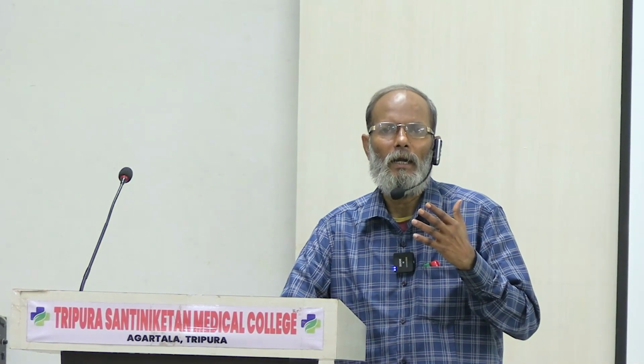Right? After giving this purgative, half hour, 1 hour, 1.5 hours after, the photograph is taken. And if the photograph again shows gas shadow, then we put him under purgative once more. All right. We put him under purgative once more.